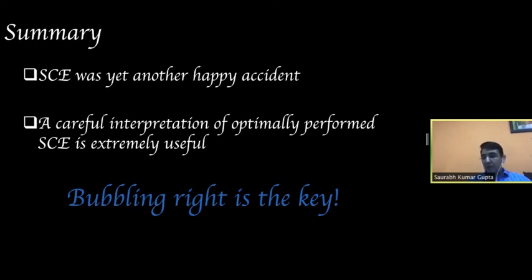And a tagline I would say is, bubbling right is the key, and bubbling right includes everything from patient selection to site selection, to preparing the injection, to preparing yourself, to selecting the echo settings, and almost everything included in performing an optimal saline contrast echocardiography.